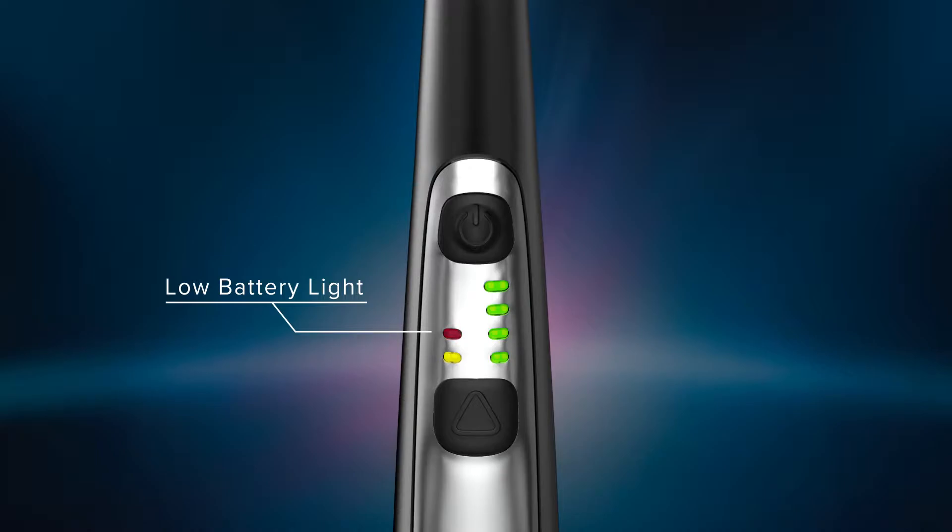If the battery charge becomes too low, an audible three-beep warning sound will occur, and the curing light will not allow further operation until batteries are recharged or new batteries are inserted.